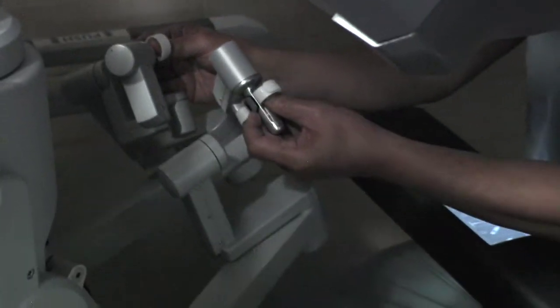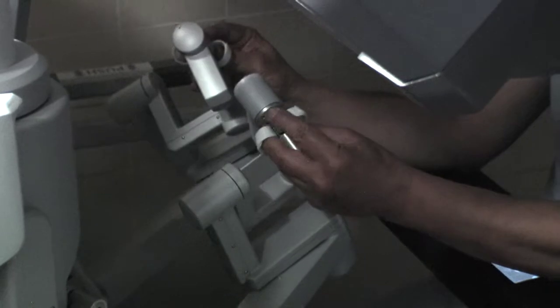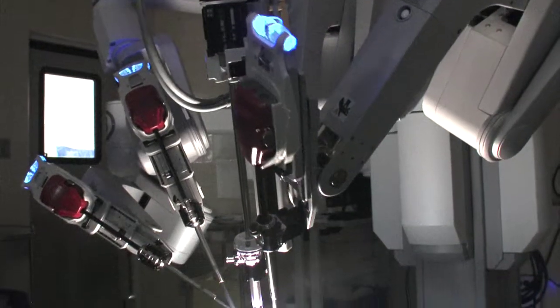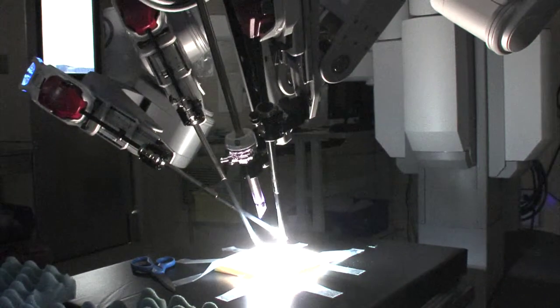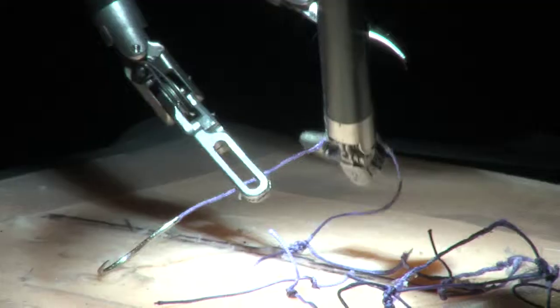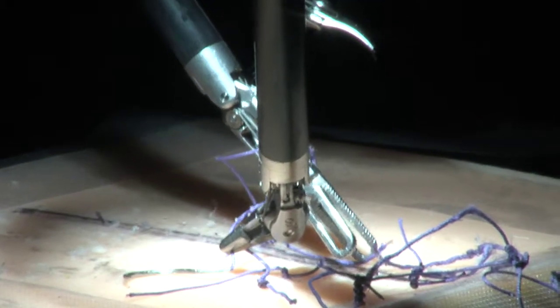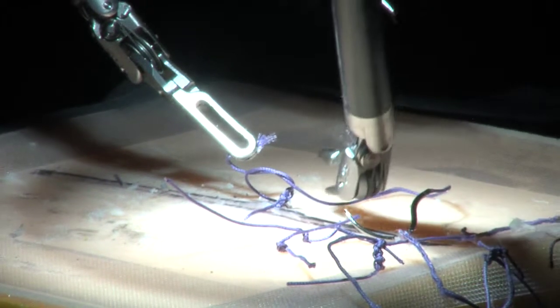That is the second point, right here, is that you can do meticulous dissection because of that. And then when you suture the bladder neck back to the urethra, because of all this superior visualization, I can actually suture things much more precisely, no guesswork.